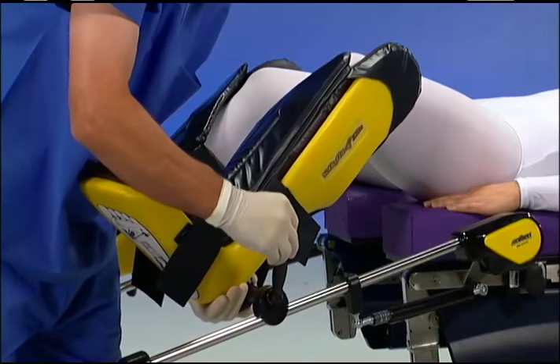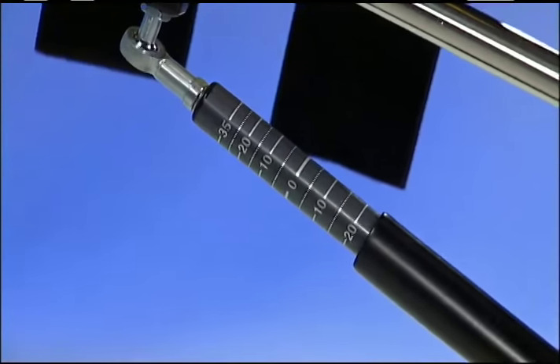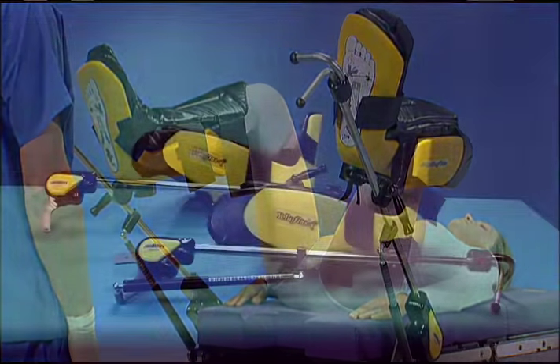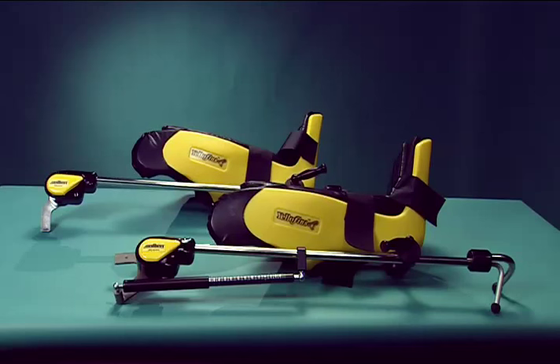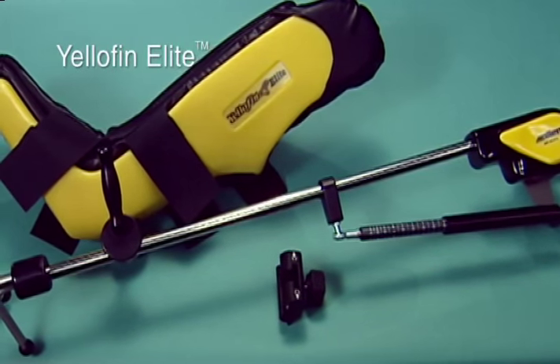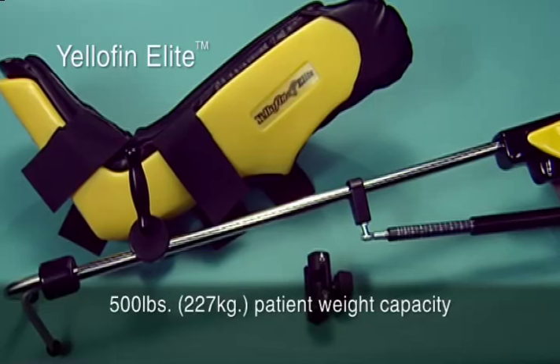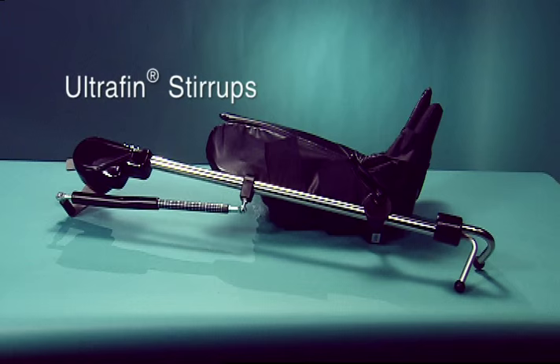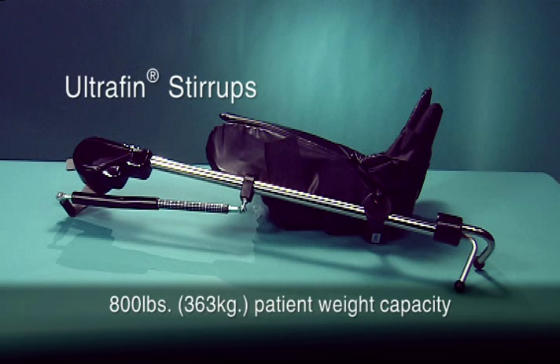This in-service video will familiarize you with the operating features and clinical benefits of Allen Medical's Yellowfin and Ultrafin stirrups. There are three different models of Yellowfin stirrups: the Yellowfin and Yellowfin without LiftAssist, which have a patient weight capacity of 350 pounds (159 kilograms); the Yellowfin Elite stirrups with a capacity of 500 pounds (227 kilograms); and the Ultrafin stirrups for larger patients with a capacity of 800 pounds (363 kilograms).